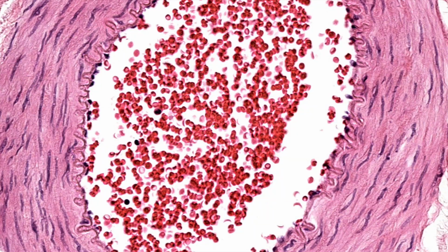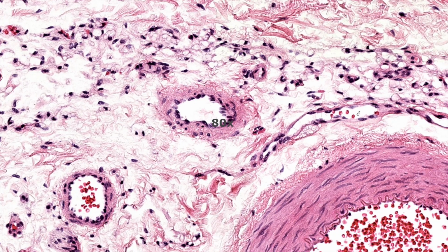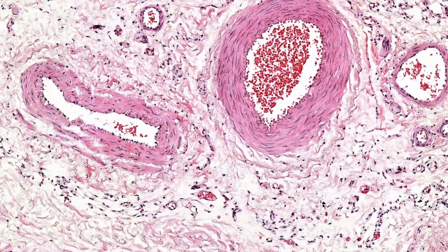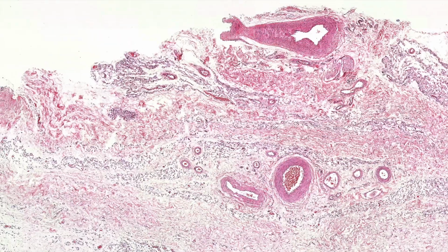I'm not sure. I got a new computer, and now when I zoom in at really high power, I can see this meshwork of geometric lines, weird pixels, that I assume is something with the way my graphics card is displaying this. But it's so bizarre because I'd never seen that before. And then I saw it and I thought, oh, it's a weird scan. Then every slide looked that way, and I thought it must be something with the way my new computer is displaying. I just have never noticed that before. I promise it's real. You guys can come to my office and see in person. But anyway, sorry for the diversion. I just noticed it again and I thought it was wild.